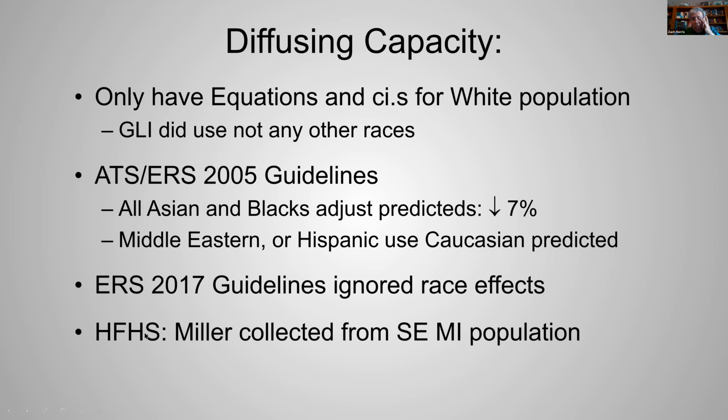One of the reasons we've stuck with Miller, Ford Hospital, and we talked about that a lot a couple of years ago when they first came out, is Miller collected his population from Southeast Michigan. That's where he did it. So he was a U of M guy back a number of years ago, studied hundreds of people in Southeast Michigan. So, I mean, you can't get a better demographic population than that.